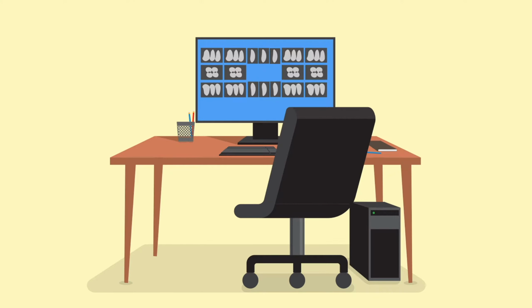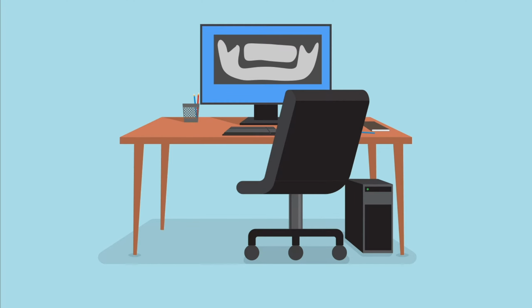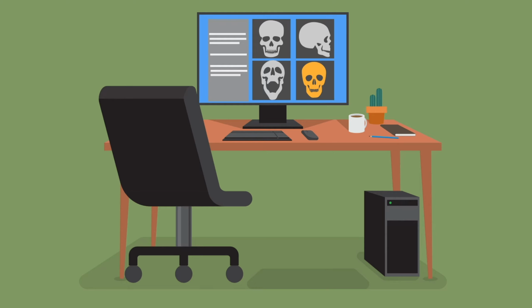Based on the clinical examinations, signs and symptoms, and previous images, you may want to order a full mouth set of radiographs. You may also realize that only 4 bitewing radiographs may be sufficient for the current clinical situation. Depending on the clinical situation, you may order a panoramic radiograph, as a full mouth series may not answer your clinical concern. For some clinical situations, a full mouth series or a panoramic radiograph may not be sufficient. You may want to get a cross-sectional imaging such as a CBCT scan, a CT scan, or an MRI.